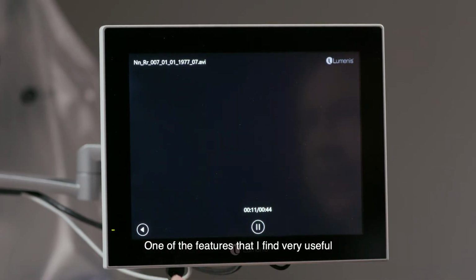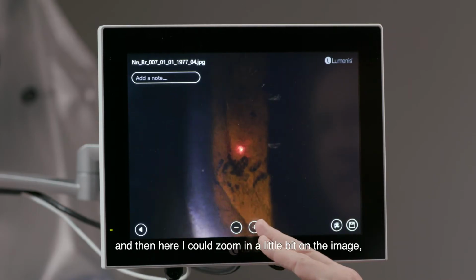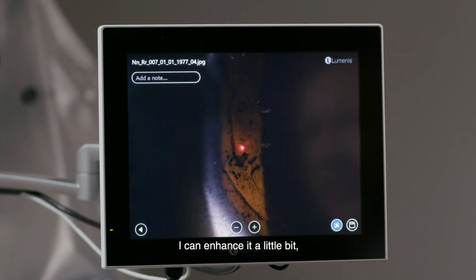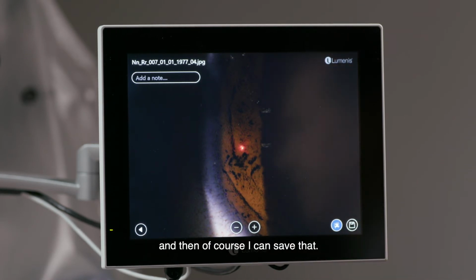One other feature that I find very useful is the ability to edit images. So I've selected an image from my library, and then here I could zoom in a little bit on the image. I can enhance it a little bit. I can add a note about anything particular I think I may want to remember for the future, and then of course I can save that.